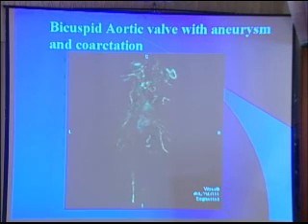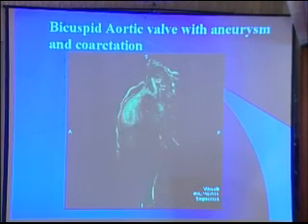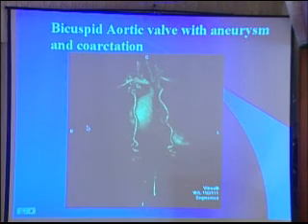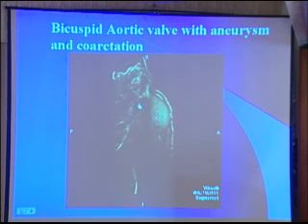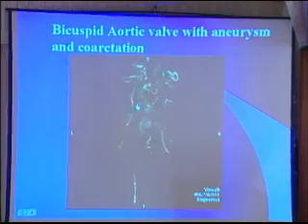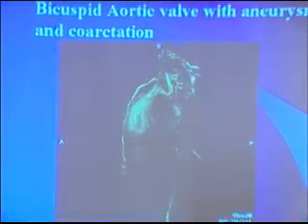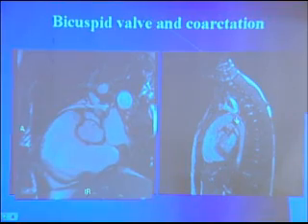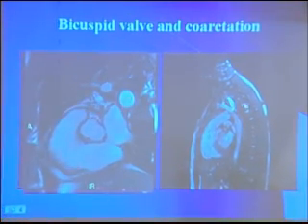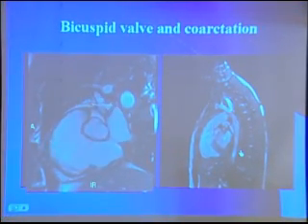This is a young girl in her 20s who has a bicuspid valve that was not diagnosed, and had this massive ascending aortic aneurysm, as well as a very tight coarctation — a narrowing of her distal thoracic aorta. To get around this narrowing, she developed these massive collateral vessels, other channels to try to get blood flow to her abdomen. This is her bicuspid valve with two leaflets. You can see the tight narrowing, which was only a couple of millimeters in diameter, and these large vessels trying to get around it. She was operated on and is doing quite well.